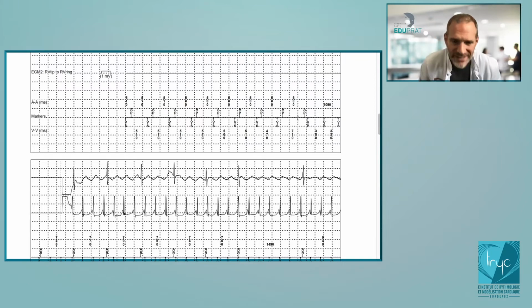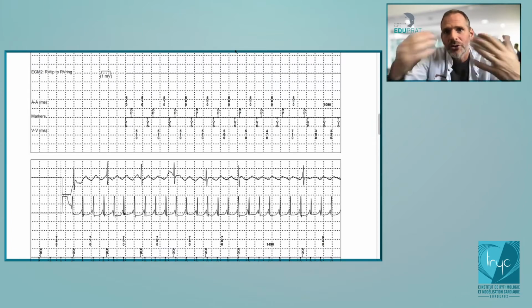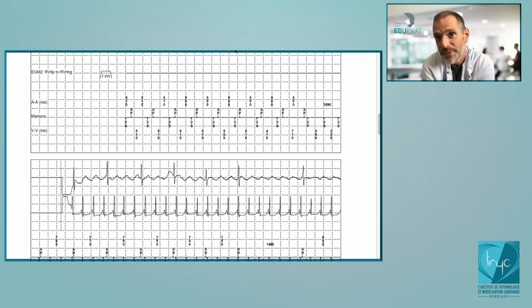So from these observations, something that you need to know also is that in Medtronic devices, there is no systematic recording of the switch from AAI to DDD. You do not systematically record an EGM. That's different, for example, in Boston with the Rhythmiq algorithm, where every time you switch from AAI to DDD, you will record an EGM. That's not the case in Medtronic devices. So there is not a lot of tracing with MVP, of course, because it is not recorded.